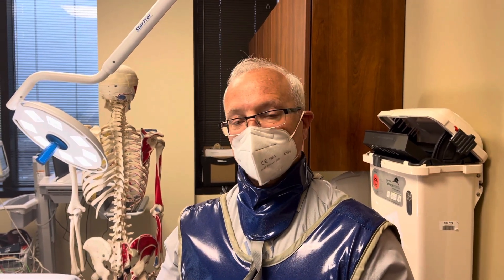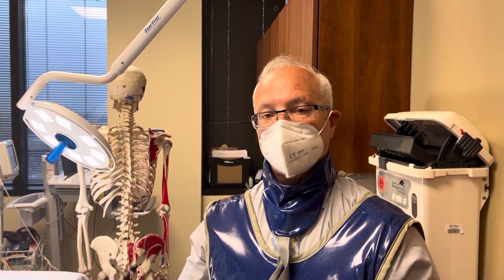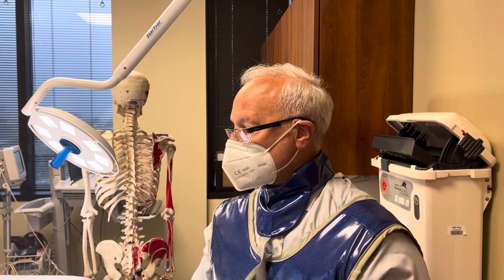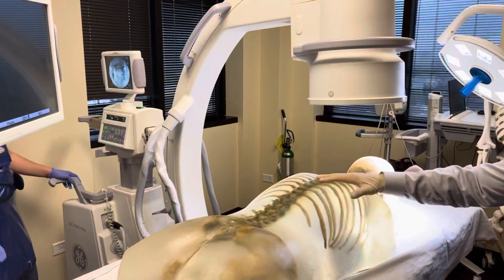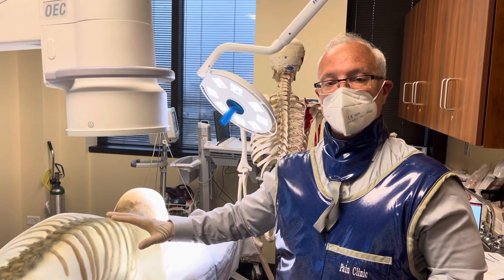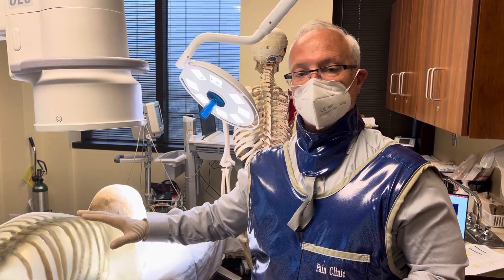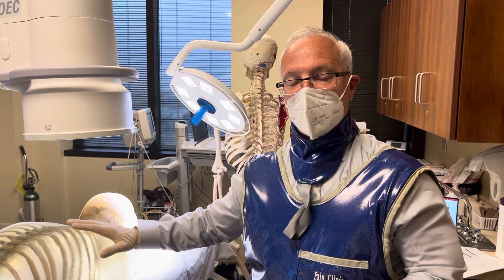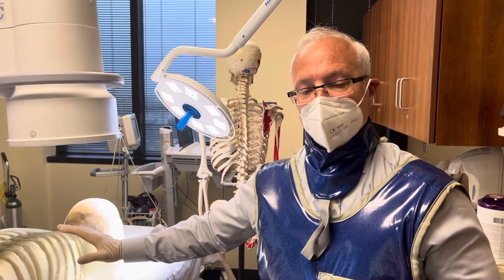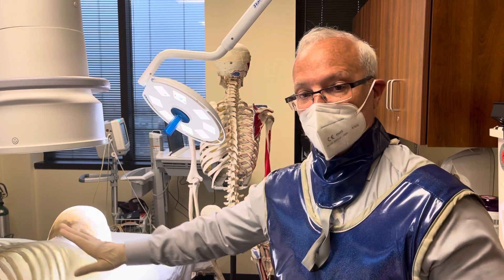The greatest considerations are safety, so every patient must have a free-flowing intravenous line before commencing atlanto-axial and atlanto-occipital joint injections. Sedation is not obligatory; some individuals including myself do not utilize sedation for this purpose. I perform this procedure with the patient in the prone position, starting with fluoroscopy posterior to anterior and then lateral. We would not do bilateral joint injections on the same patient at the same setting, but we could do an AO atlanto-occipital and an AA atlanto-axial joint injection on the same patient, same side, same setting.